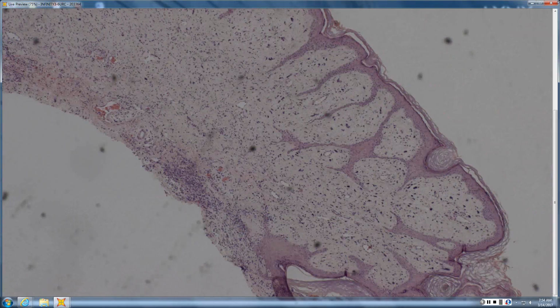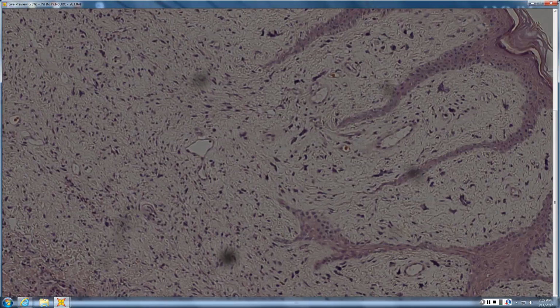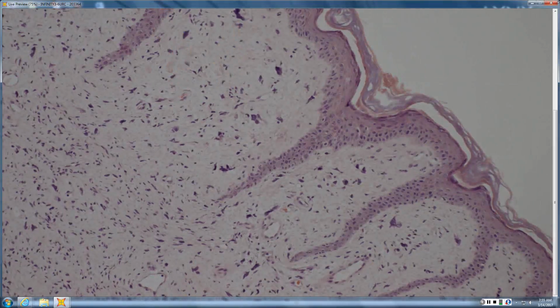So there are these nice fibroblast cells, almost looking like radiation fibroblasts in the dermis. Big, huge, atypical cells that look like radiation fibroblasts. So I think this is the infantile. There's something that I'm supposed to know with that. I don't remember which one has those. So what kind of fibroma would have such big pleomorphic nuclei?